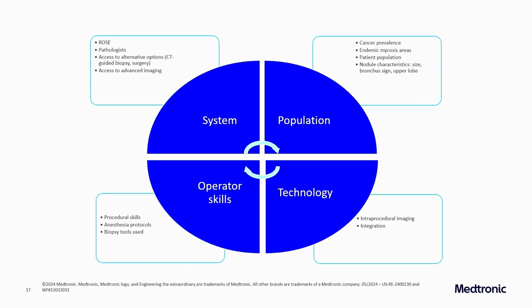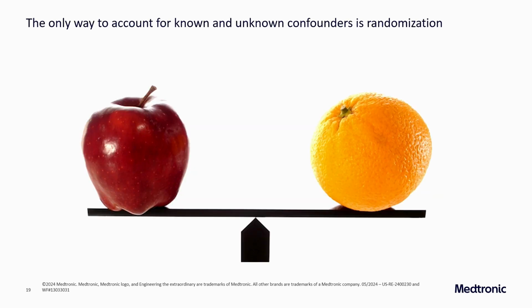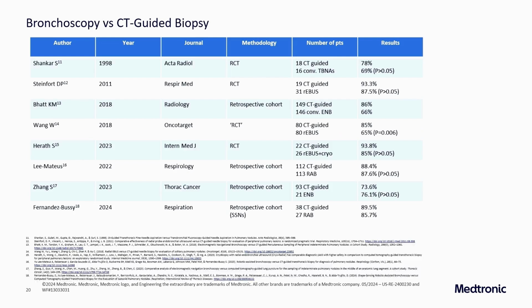Like somebody doing bronchoscopies in the afternoon. It's like the judges giving more favorable verdicts after lunch. Maybe you're better in the afternoon or the morning. All these things you need to balance. The only way that we know to do this is with randomization. And so this is why it's absolutely critical, given the incredible and unprecedented technological advances in bronchoscopy over the past 10 years, that we start doing good, methodologically solid randomized controlled trials. And this was really our incentive for doing this study.